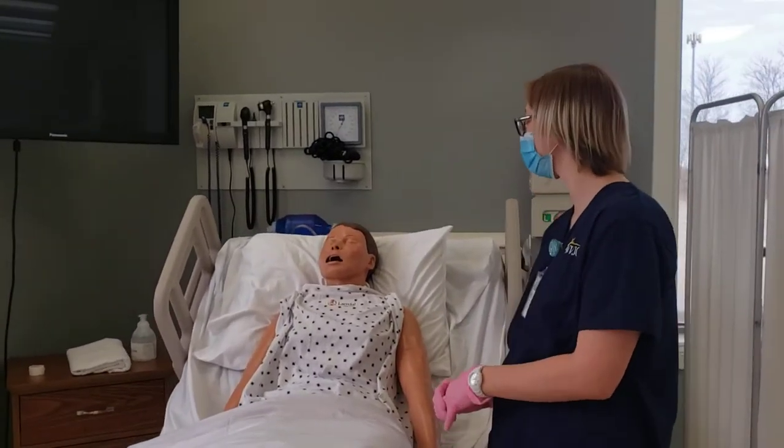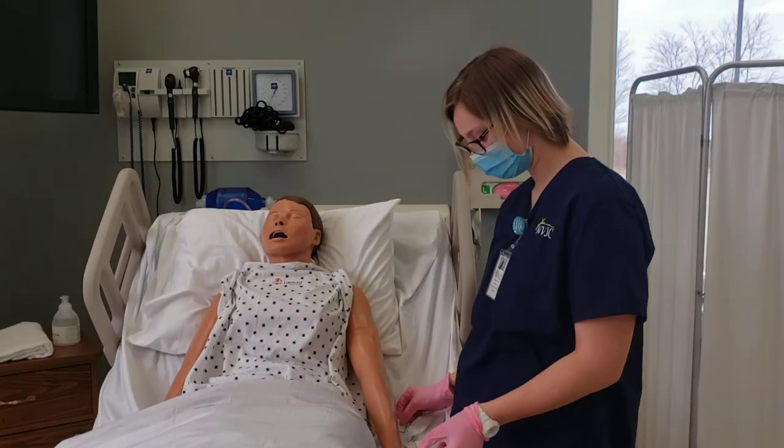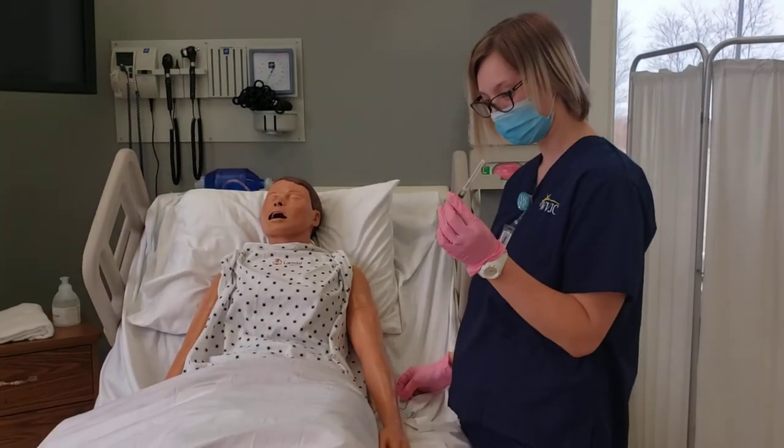Mr. Smith, I'm going to do your IM injection now. Leanna has already identified the syringe, gauge, and length of needle for the patient size.